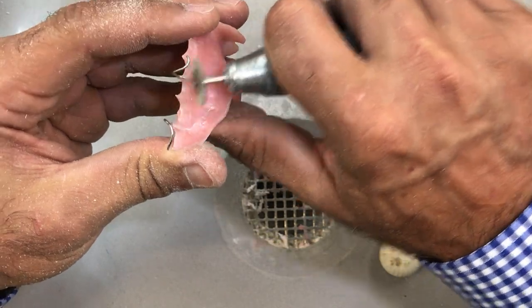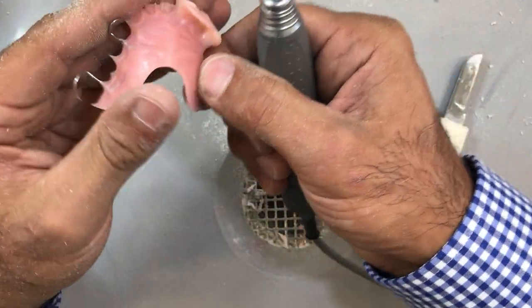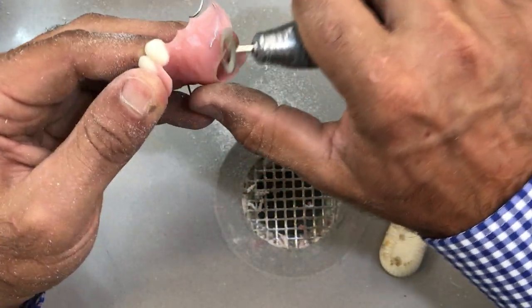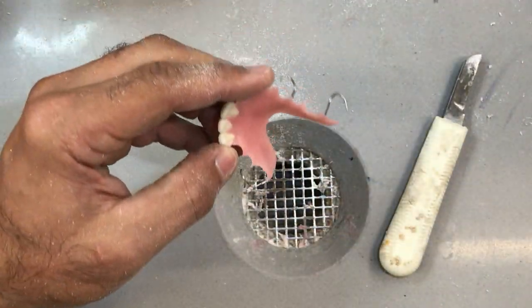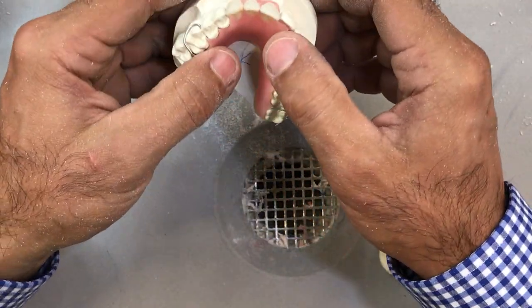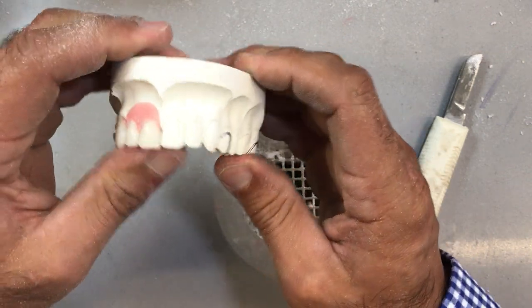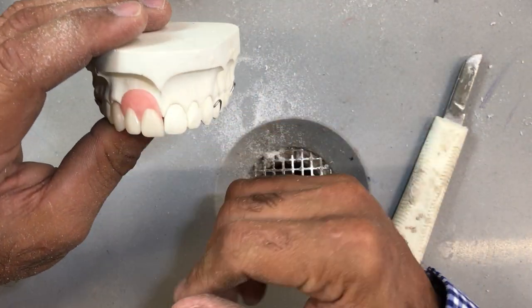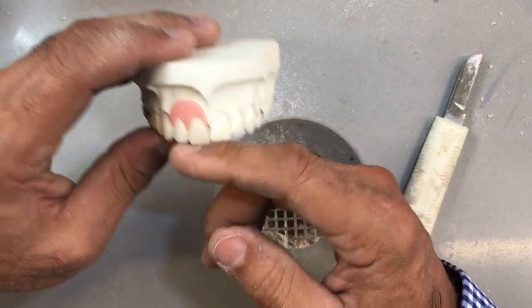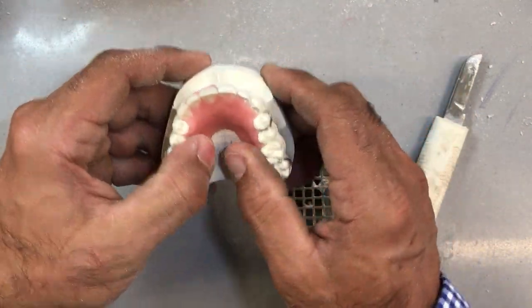Polish a little bit on the inside. Let's fit this back on our duplicate model to see how everything looks. It's a nice tight fit. Again, this central appears to be a little bit longer — don't trim it back before you assess it in the patient's mouth. If it looks the same intraorally, then you can zip it back a little bit and polish it. Go back to the lower and finish the trimming.